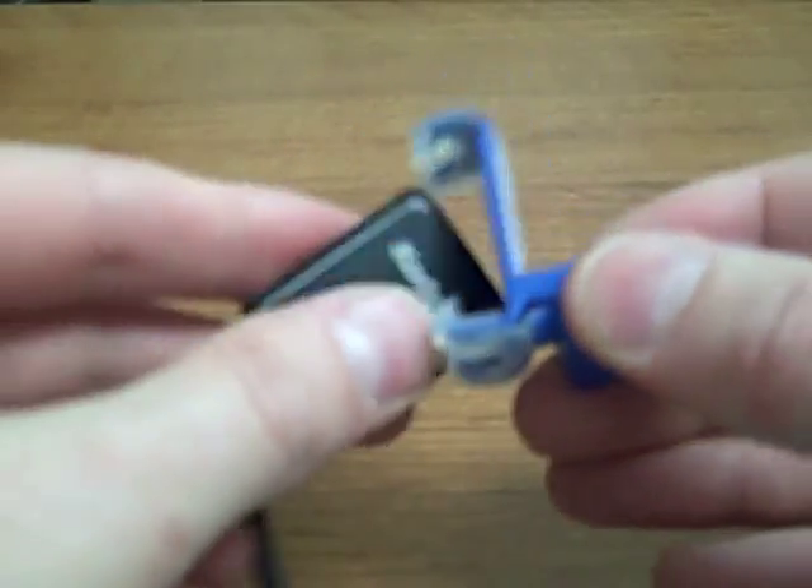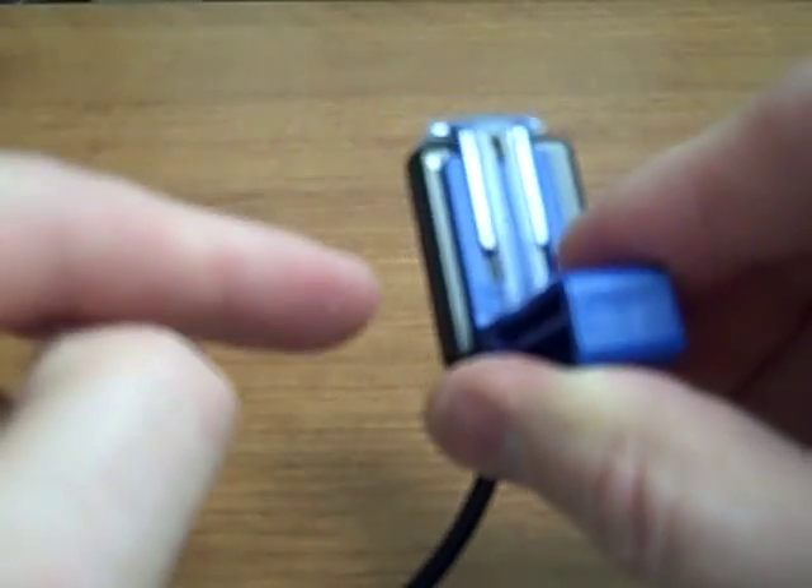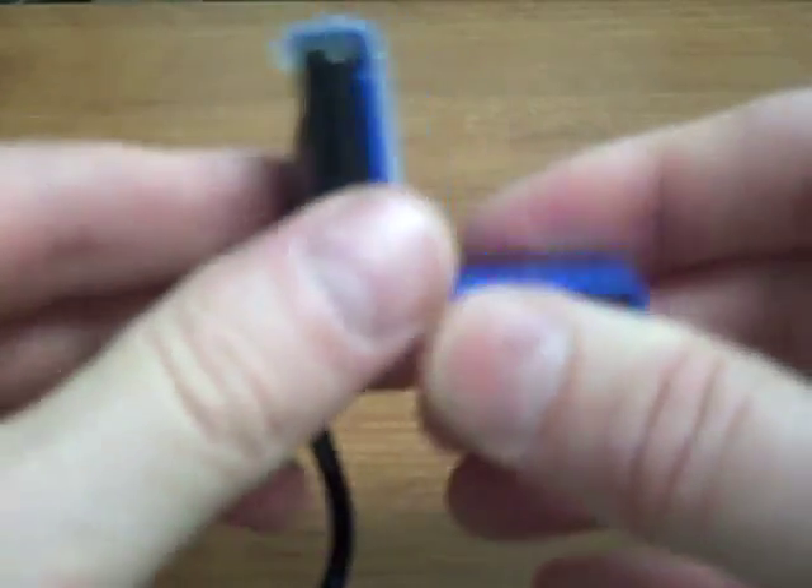This same bite block will work with a size 1 sensor. Always want to load the sensor with the active area towards the bite surface.